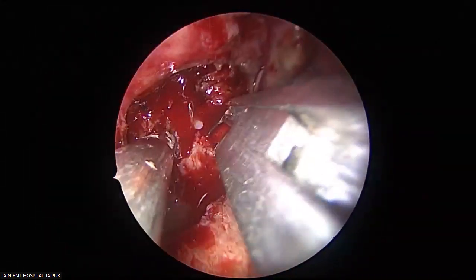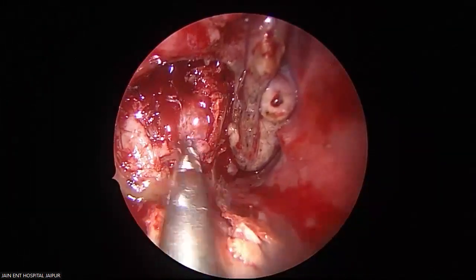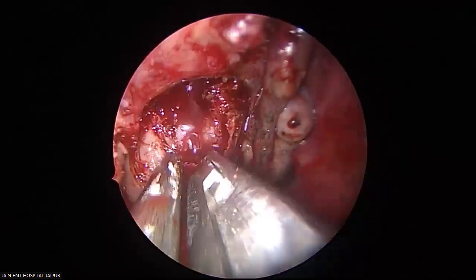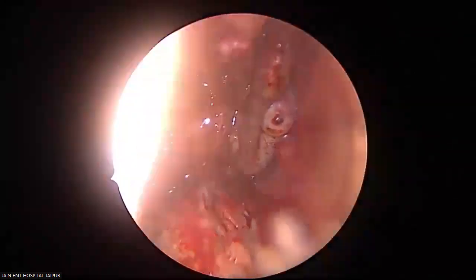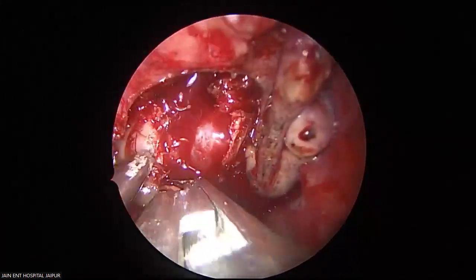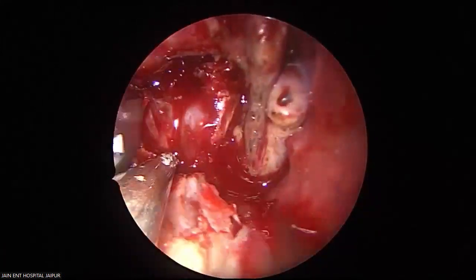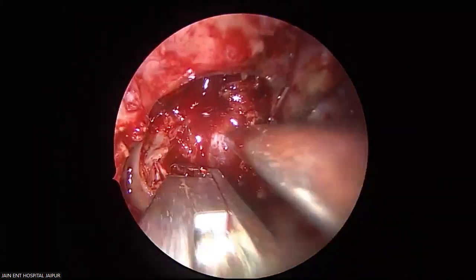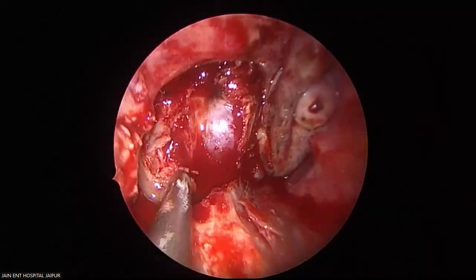You can use drill, punches, whatever, to remove this bone adequately. Nothing is hard and fast the way you are used to. You can do that. I have been widening a little more extensively because we have a huge lateral component. I need to create adequate space to bring it inside.